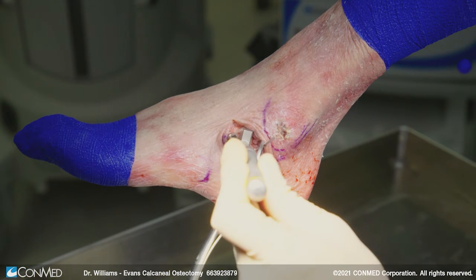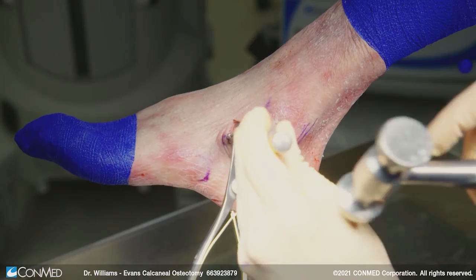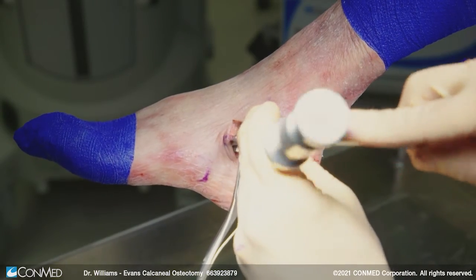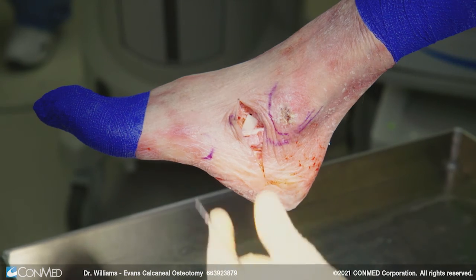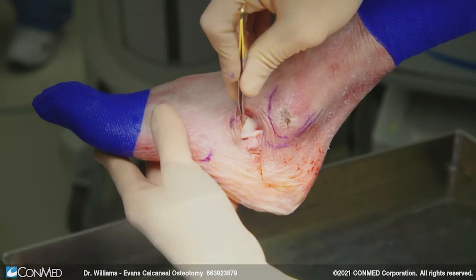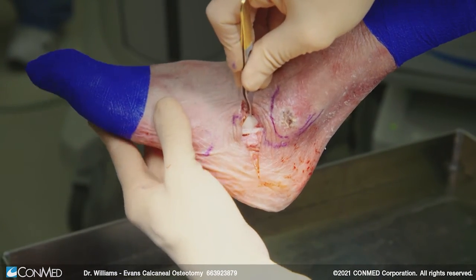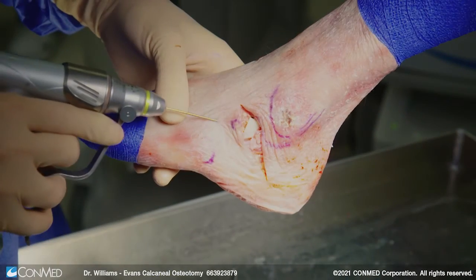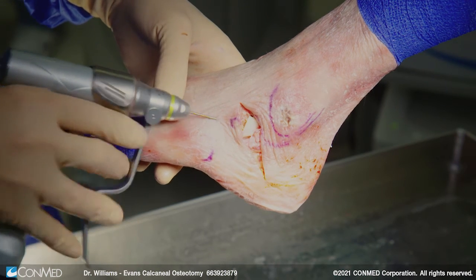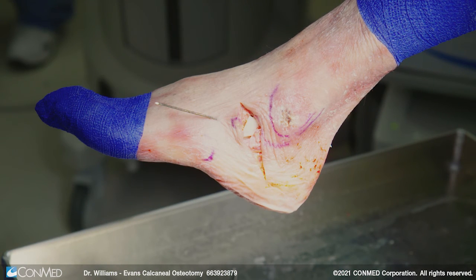You want to have it pretty well set, and the tamp is just to simply help you get the final position. Just like that — I can remove my retractor and then my graft sets nice in there. Now fixation-wise, this becomes a point of controversy: do you need to fixate your grafts? Sometimes yes. So if I want to fixate my graft, cap your K-wire, leave that protruded, remove it in about four to six weeks, and your graft won't move.